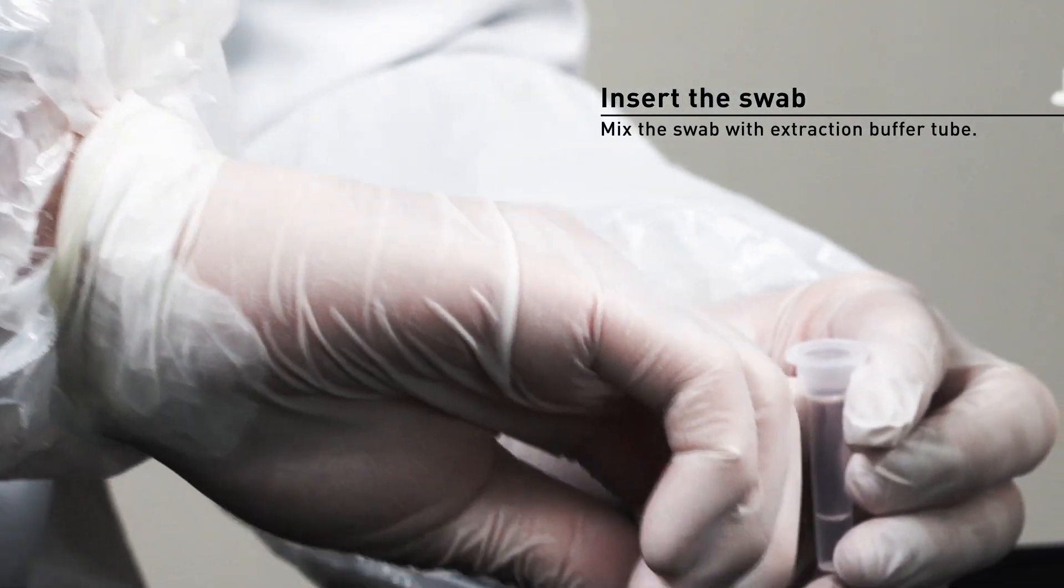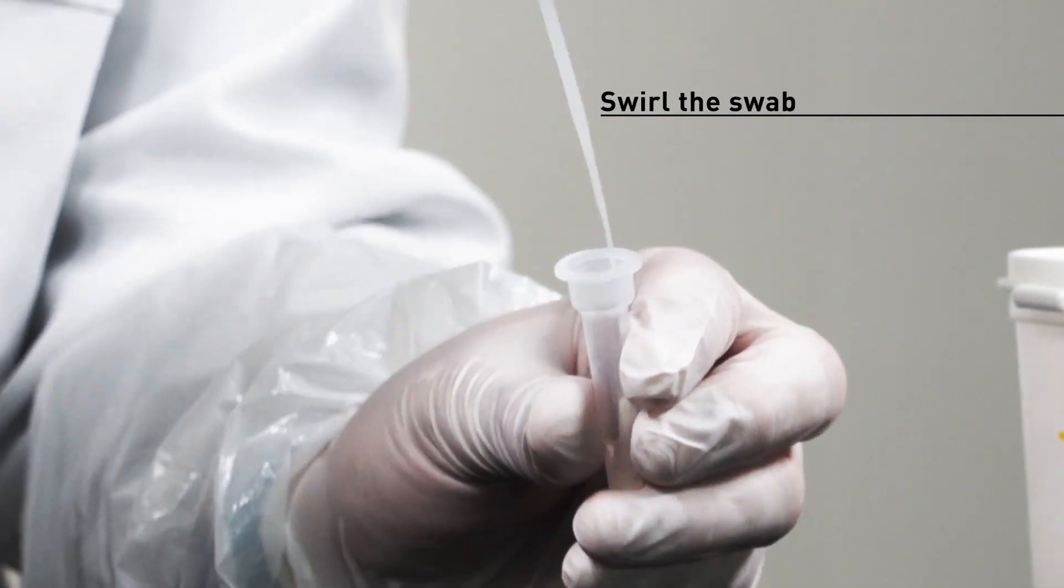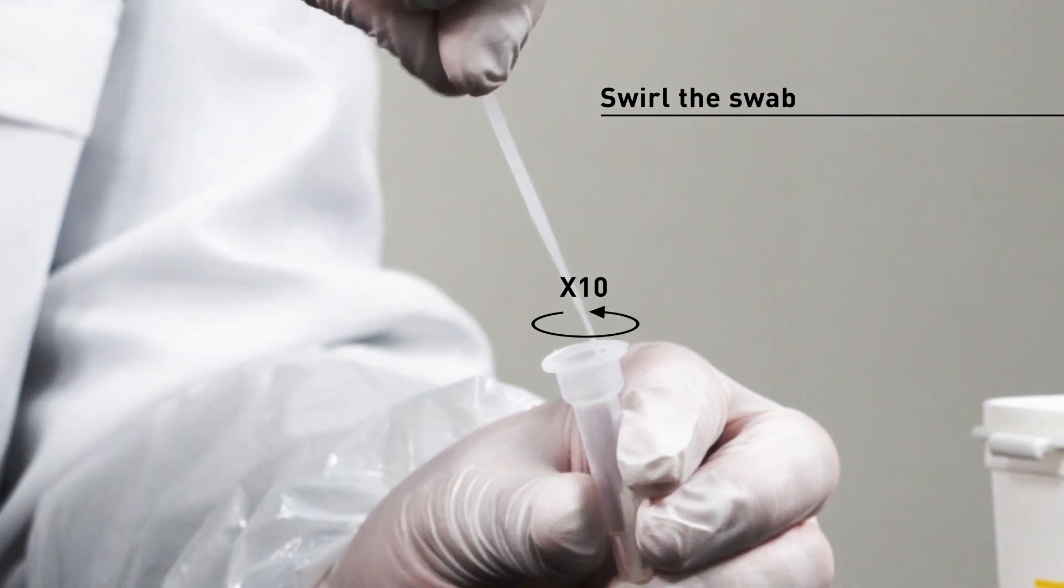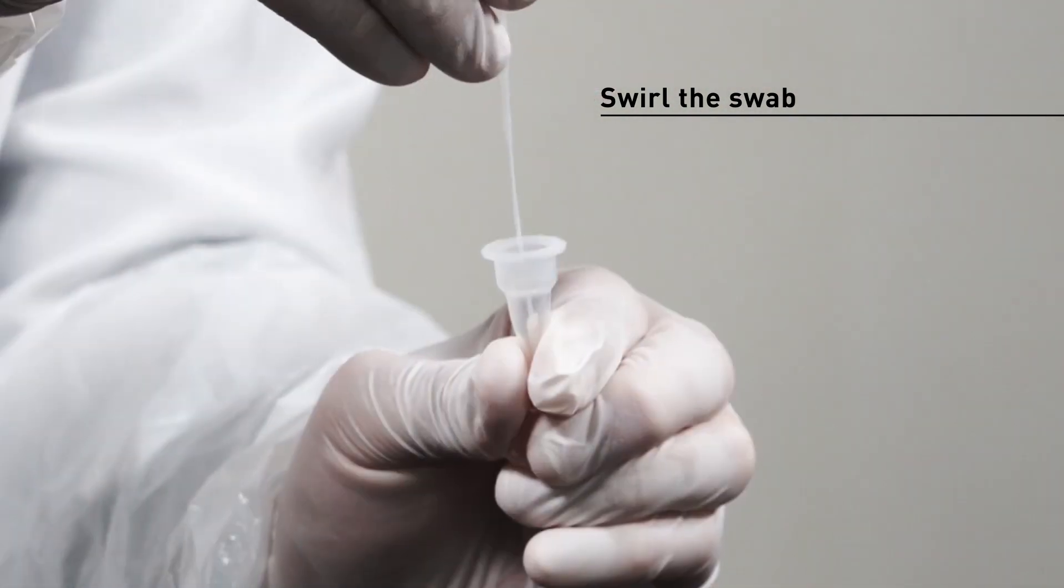Insert the swab into the extraction buffer tube containing the sample extract. Place the swab on the wall of the extraction buffer tube and swirl it at least 10 times so that the sample is extracted.